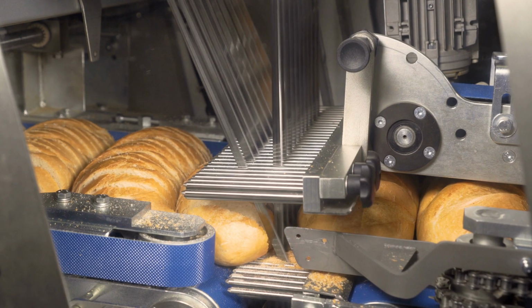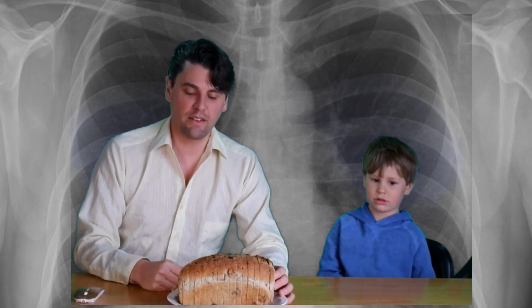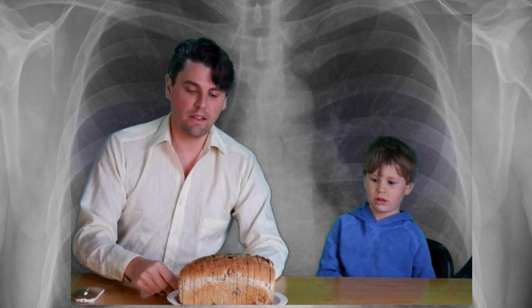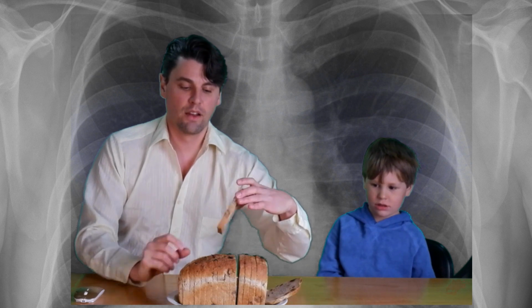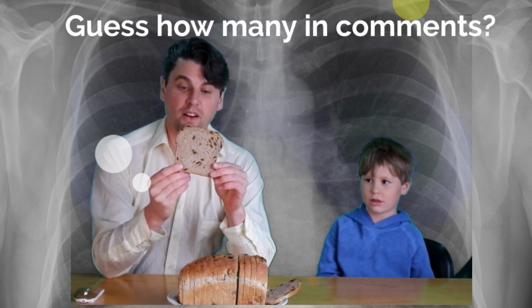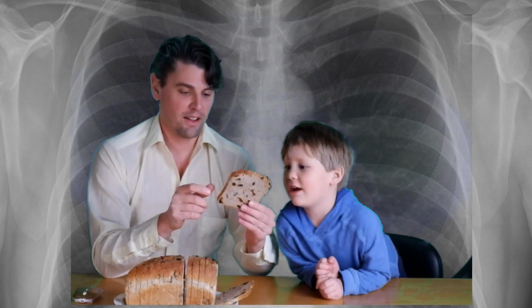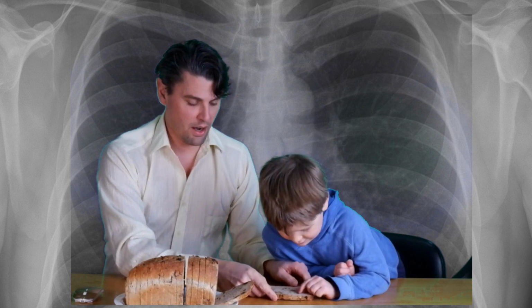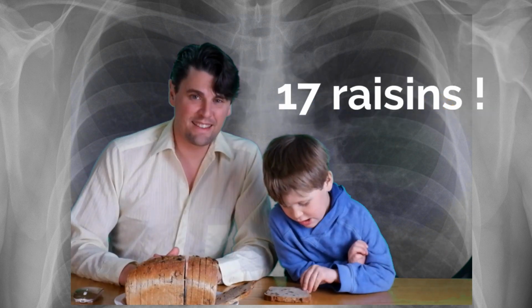The hard way would be to slice the bread up into small slices such that each slice would be about the thickness of a raisin. So there won't be a lot of raisins buried in between our slices. And then we would take the bread apart and we would look at it slice by slice. So here is a slice, and then we're going to try and figure out how many raisins are in this slice. Okay, Luca's going to start counting. 17 raisins in this slice.